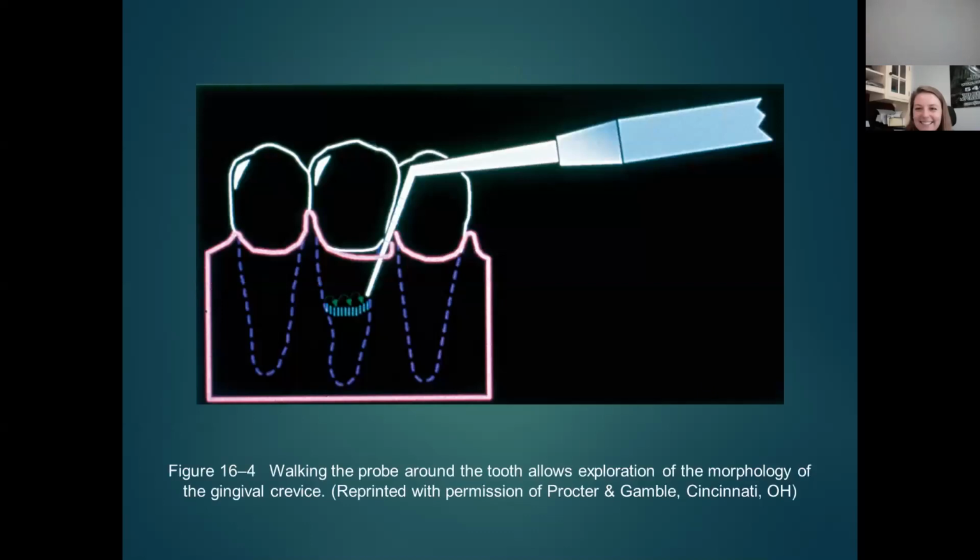So we will be checking your probing on each and every patient that comes in. That's part of the perio assessment that the instructor, until the day you graduate, will always be checking. Now, your doctor, when you're in private practice, isn't going to be checking. They will go in and spot check sometimes as part of their regular exam, or you will be calling out the specific areas that you want them to investigate. You know, are you recommending some further treatment for that particular patient?